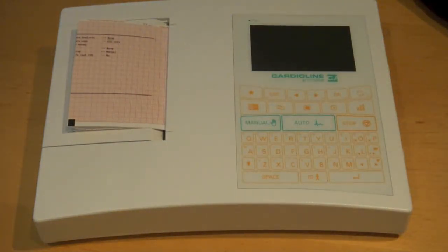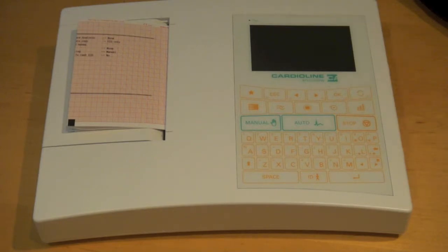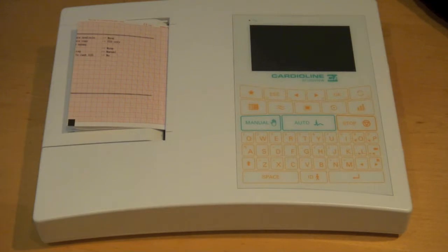The Cardioline AR-1200 is available in two versions, the AR-1200 View and the AR-1200 View with Bluetooth.